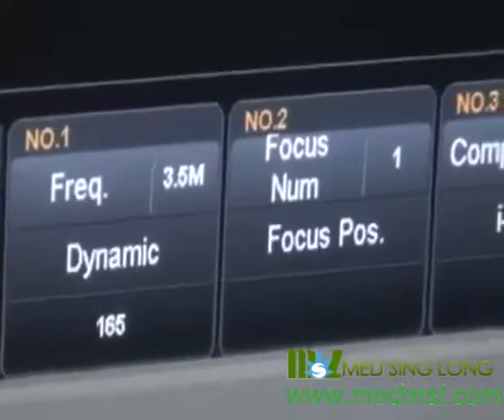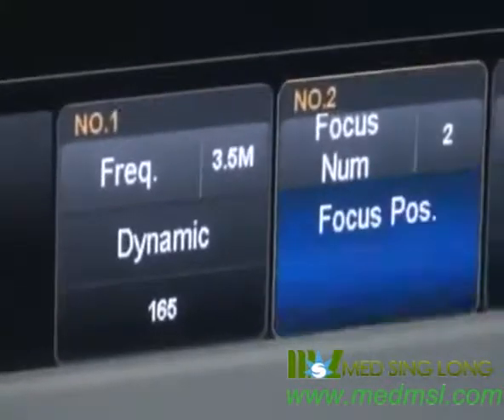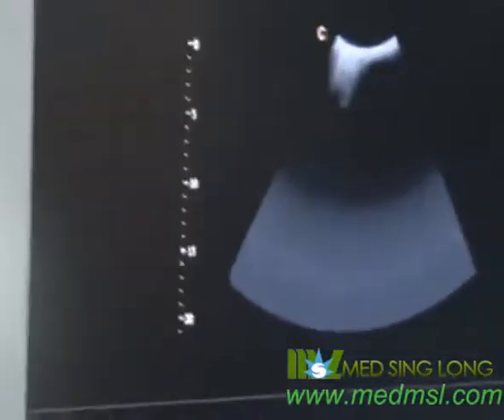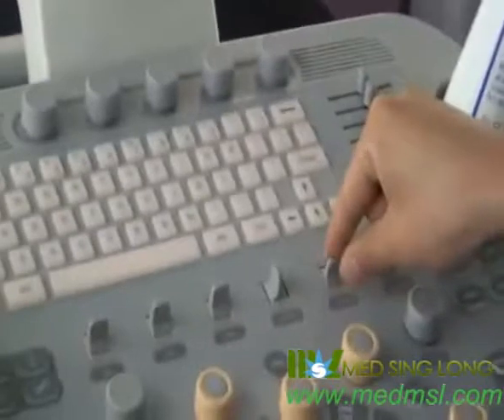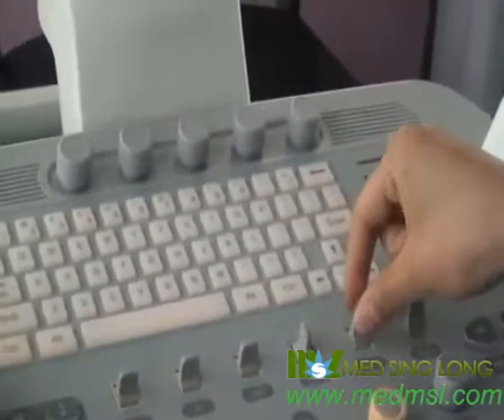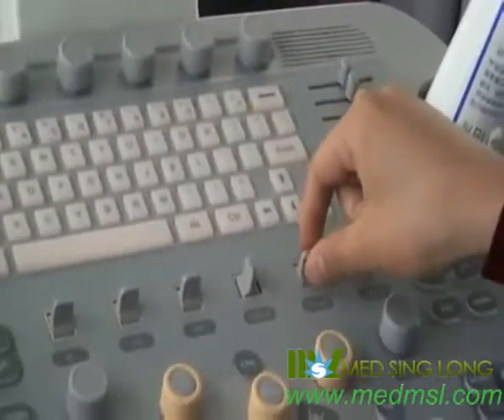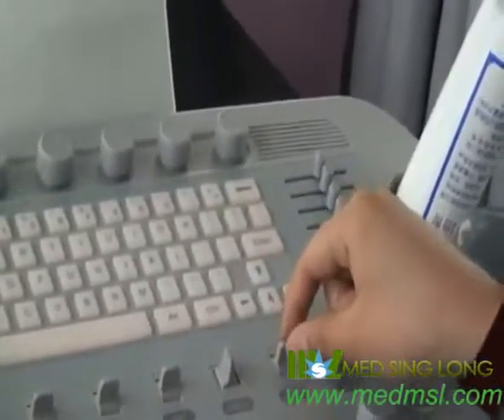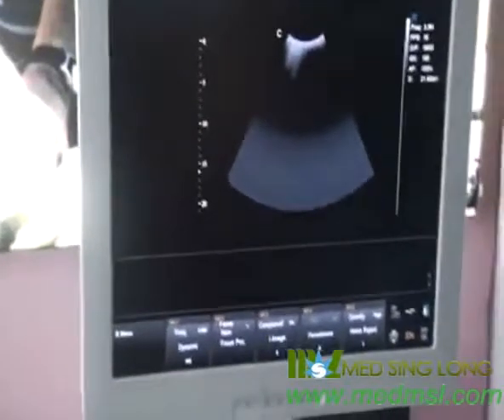For focus number and focus position, press to change the focus number and rotate to change the position. You can also use up and down to change the focus position. We should set the focus position and focus number according to our requirements, as the focus number affects the frame rate. Please keep the focus number in default mode.